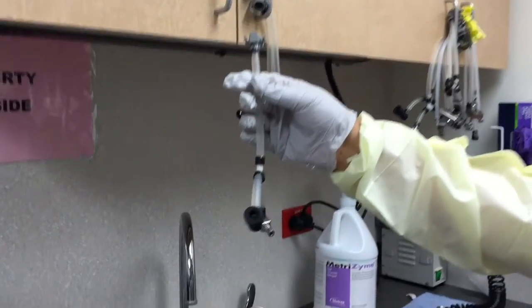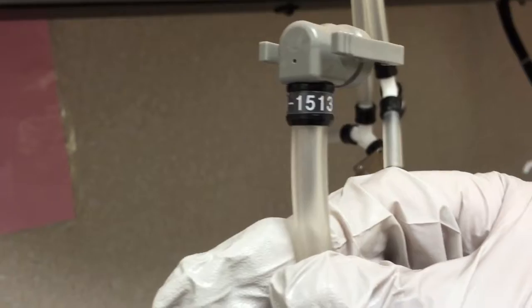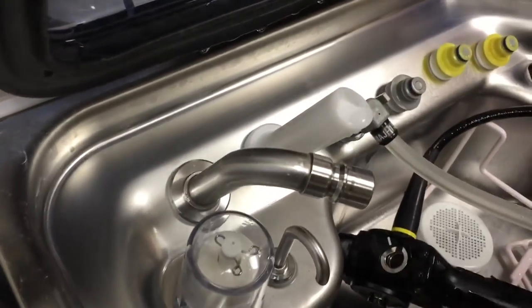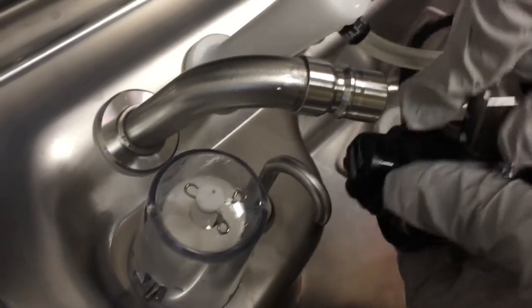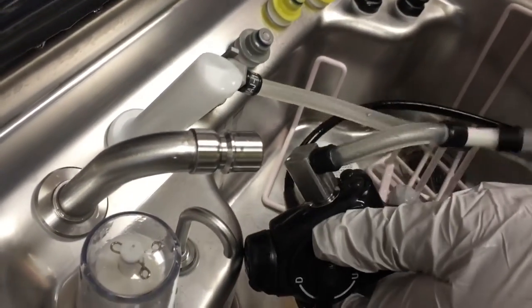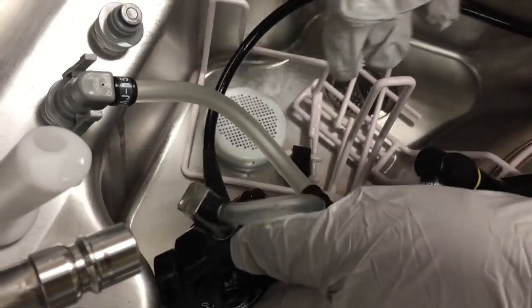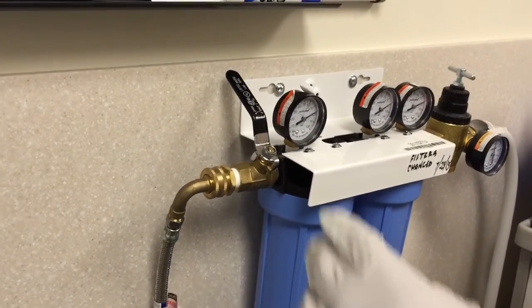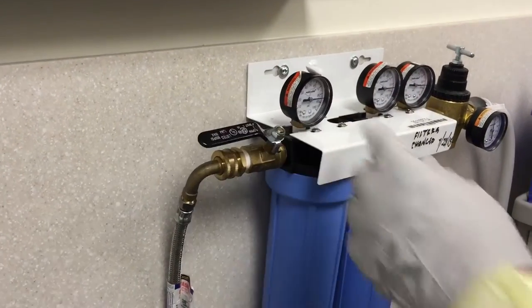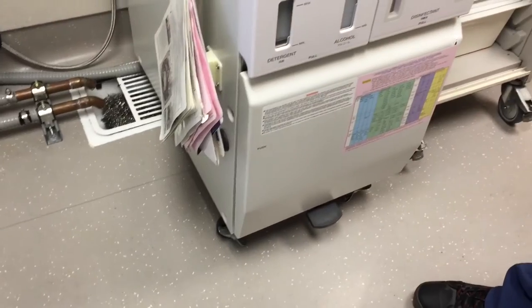Next, we're gonna take the adapter to clean the scope, which is number MAJ1513. I'm gonna make sure it's tight to the scope. Next thing, you're gonna open the water valve. Pressure. Okay, go.